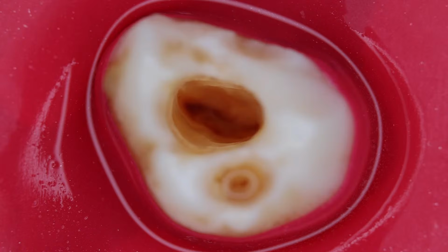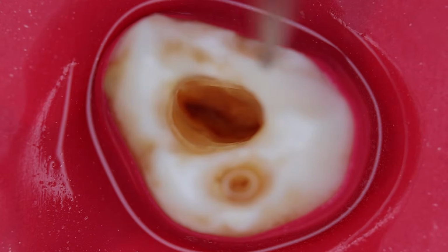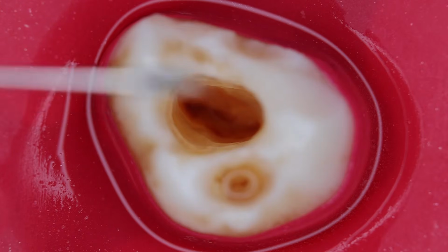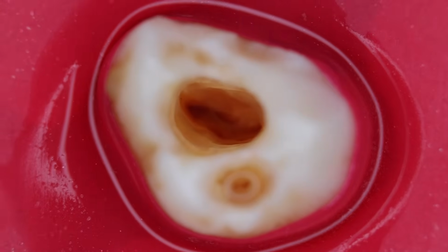Now these orifices that you see over here seem a bit smaller. So you have the option that with the recent file systems you have an orifice opener or orifice enlarger. Otherwise you can use the GG drills. Over here I am using the GG drill. You can begin with size 2 and size 3 to just enlarge the orifices. Hope now things are more clear to you, how the orifices are looking.